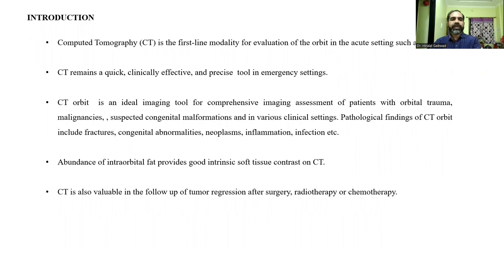Pathological findings of CT orbit include fractures, congenital abnormalities, neoplasms, implants, infections, etc. The abundance of intraorbital fat provides good intrinsic soft tissue contrast on CT. CT is also valuable in the follow-up of tumor regression after surgery, radiotherapy, or chemotherapy.